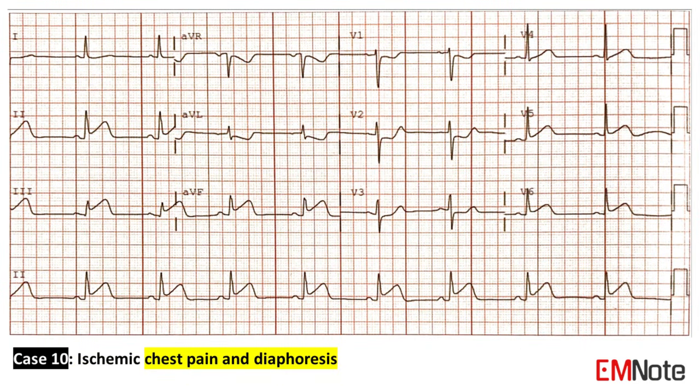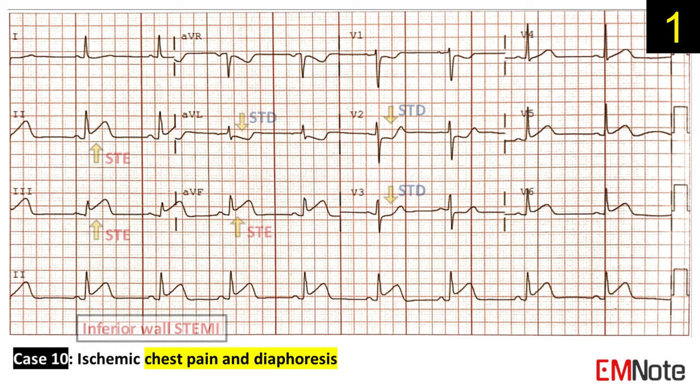Case 10: The patient presents with ischemic chest pain and diaphoresis. The ECG shows inferior wall STEMI.